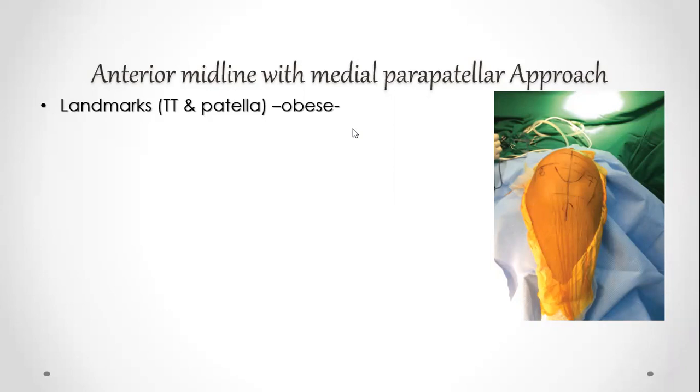Be careful about that. I will talk later about some tricks and principles during the operation, how to put the tourniquet and put the side supports on the knee, because it is very crucial. Together, we will have a well-positioned lower limb during a total knee replacement.